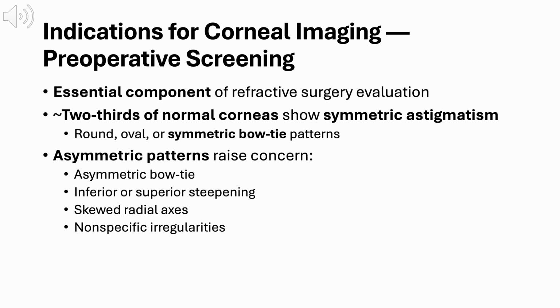This slide is really about why corneal imaging is non-negotiable before refractive surgery. Corneal imaging is an essential part of the preoperative refractive surgery evaluation because it helps us decide who is safe to treat and who is not. We're not just measuring refractive error here, we're screening corneal structure.